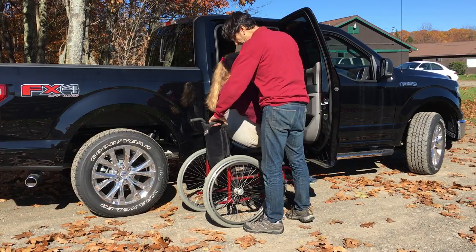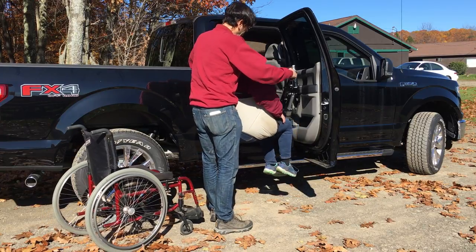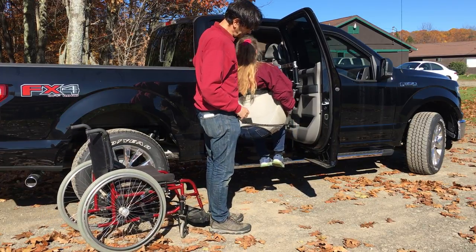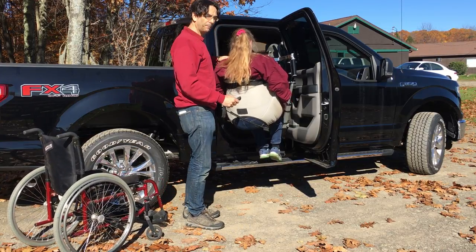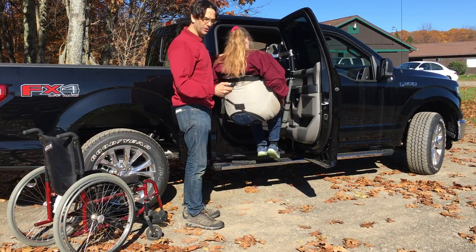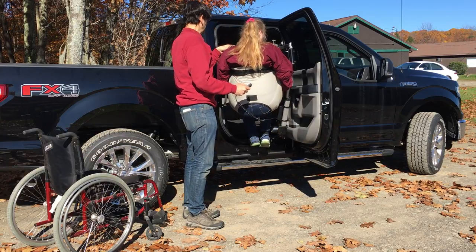Now, once we're up and off the seat, we're going to move the wheelchair away, and you'll notice that we turn to face into the vehicle. Once we're up at the appropriate height for a transfer, the user is going to go into the vehicle feet first.